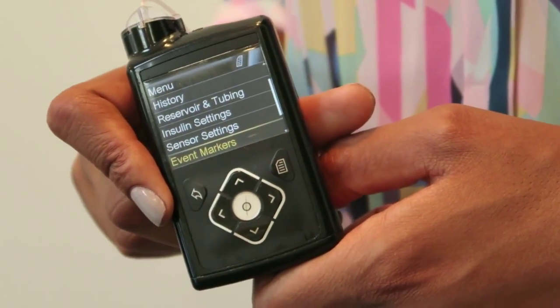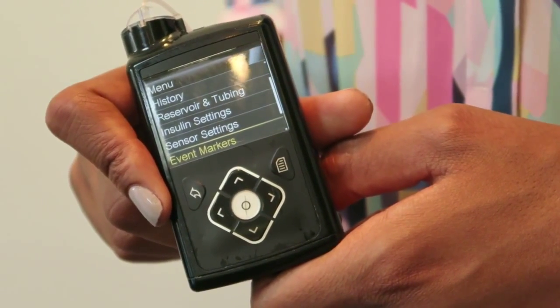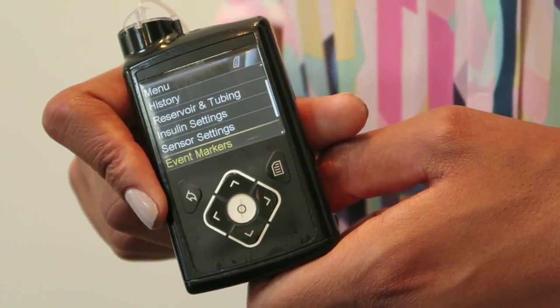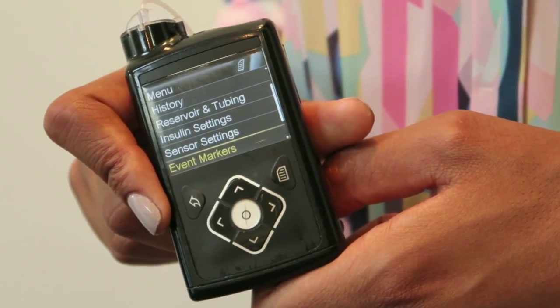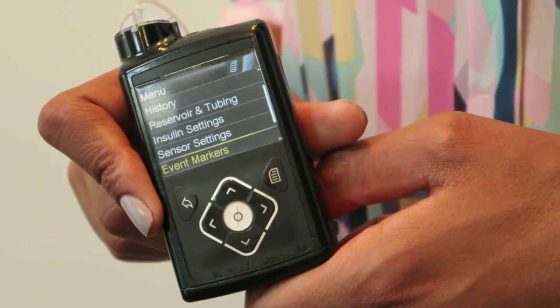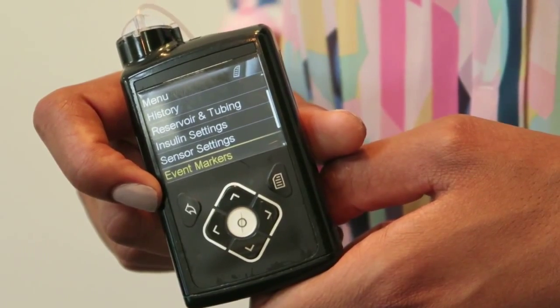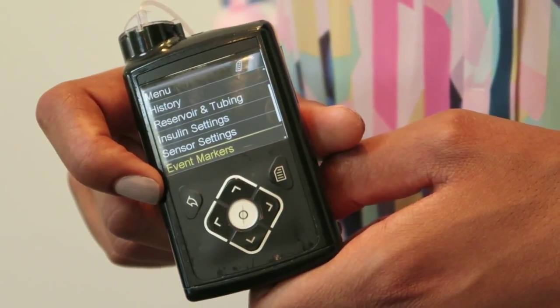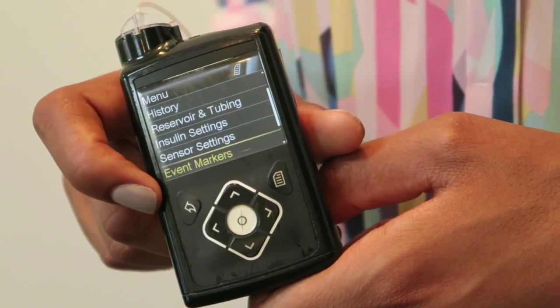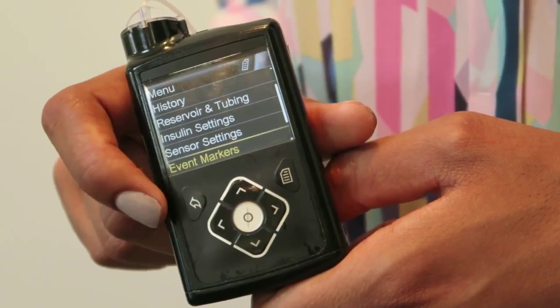One of the really clever things about this pump that I've found so far are the event markers. For example, when I've got high blood sugars and need to do a correction with a pen, the event markers option allows me to write that down and note it, so that when I upload the data later, I'm able to see what's been going on. You can also put things like exercise or blood glucose levels in as well.